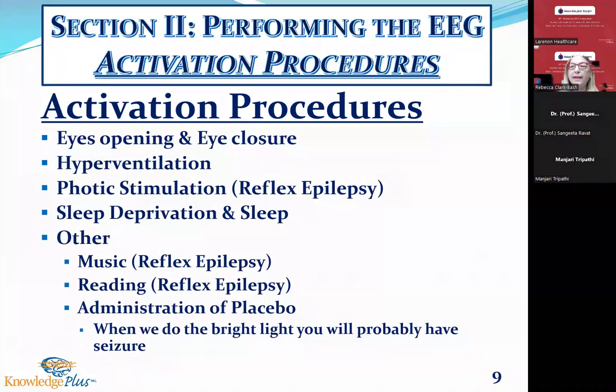Now, next, I really like to do photic stimulation. Here's the reason I like to do photic stimulation next. First of all, it's exciting to the patient. My biggest goal, especially with suspected complex focal epilepsy, used to be called complex partial epilepsy, is that that seizure classification is one of the most difficult to diagnose because a lot of the behaviors don't look like seizures. Lip licking. Is that a seizure? Most lay people think no. What if the patient simply, in the middle of talking to you, stares away? Doesn't look like seizure to lay people.